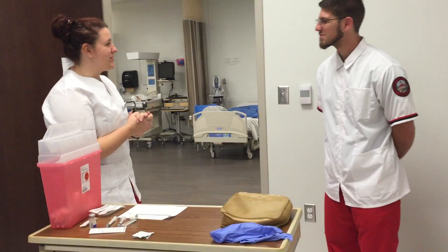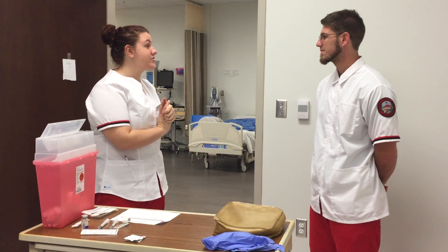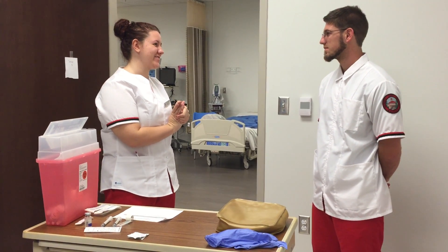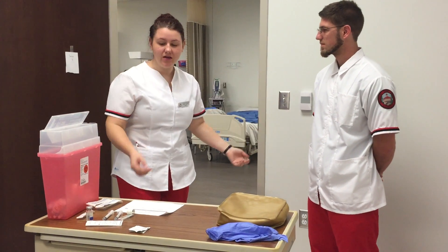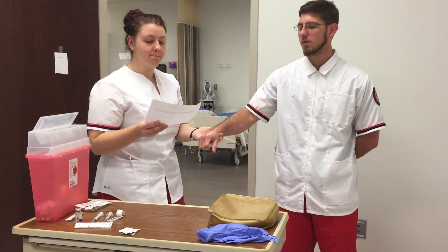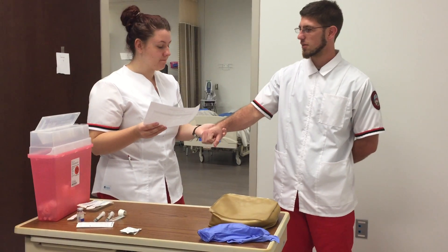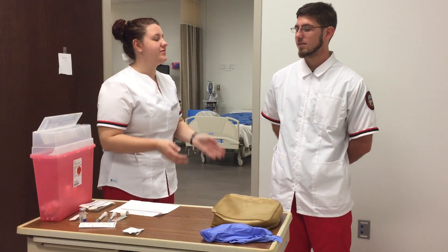Hi, my name is Shelby and I'm going to be your student nurse today. I'm here to give you your intramuscular and subcutaneous injections. Before we get started, I'm going to close the curtain for your privacy. Can you tell me your name and date of birth? Robert Weldon, September 14th, 1993. Do you have any allergies I need to be aware of? No ma'am, I do not.